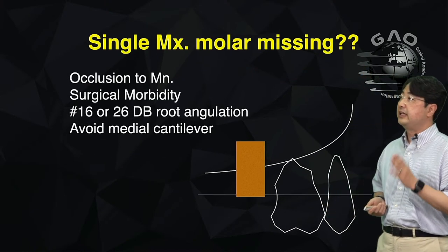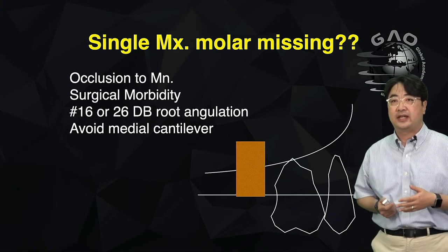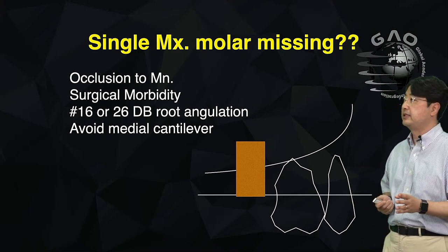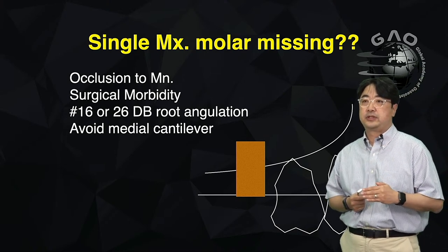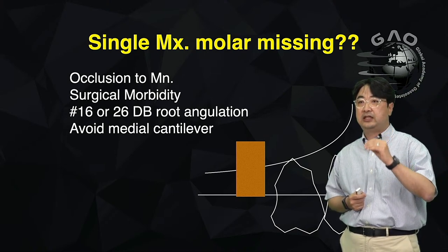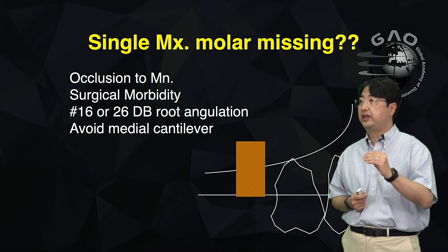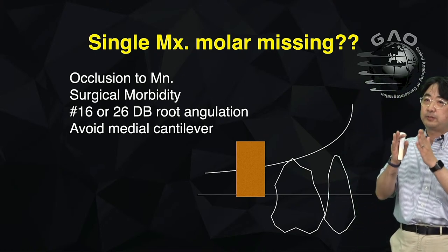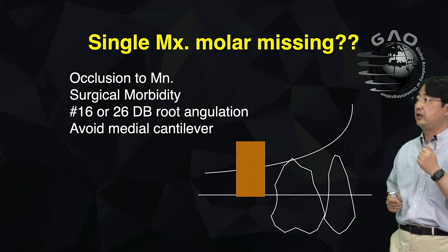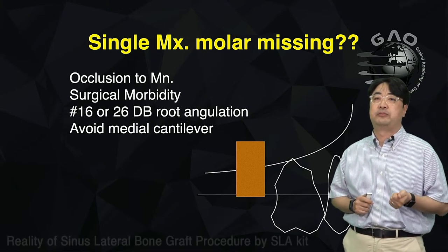For a single maxillary posterior missing, the last maxillary posterior missing, I always look at the lower first to see if we need a tooth. If so, then I'm going to go for the implant. But if there is only space for half a tooth, then I'll think about not doing the implant placement.